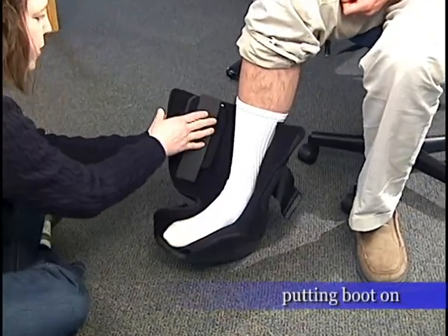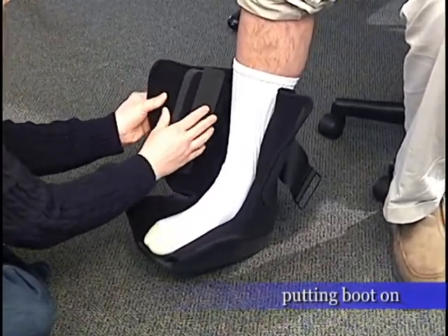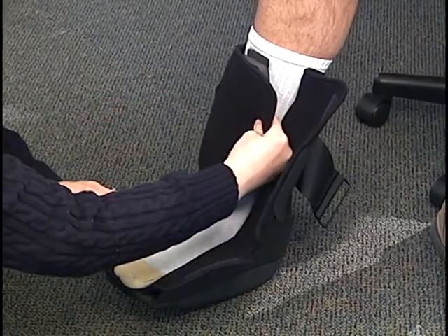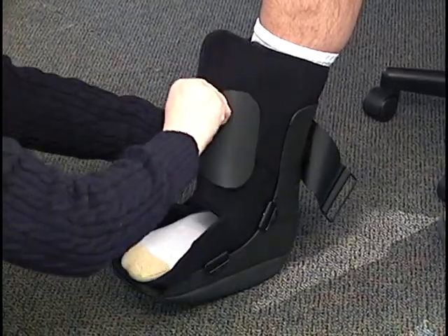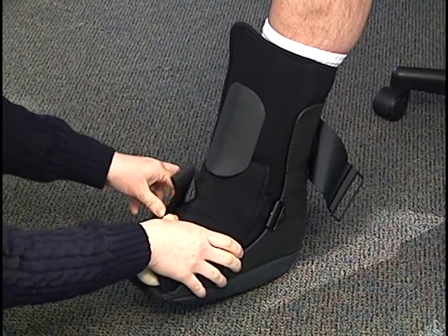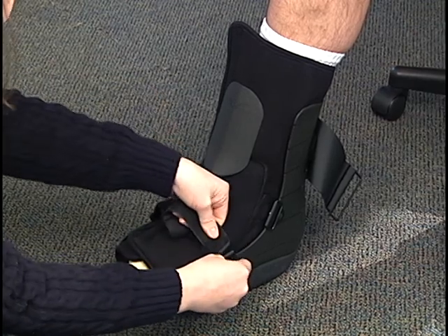Carefully place your foot back in, making sure the heel is in the back. All of this is removable and adjustable for comfort. Place it across your shin and across your foot, then throw your straps back one at a time.